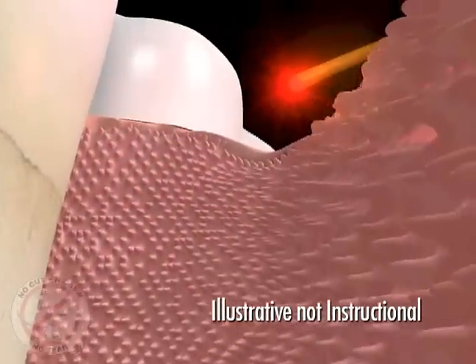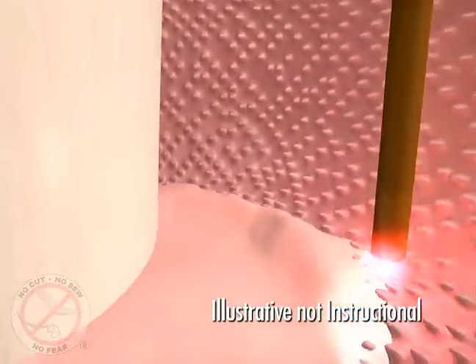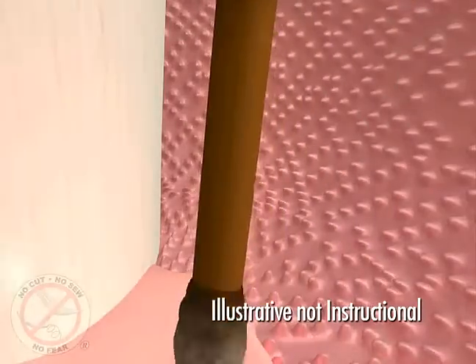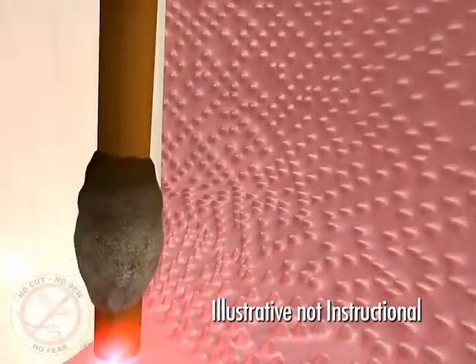Once the surfaces of the teeth are clean, the laser is used a second time at the bottom of the pocket to remove any remaining debris and to sterilize the pocket, soft tissue, root, and bone.